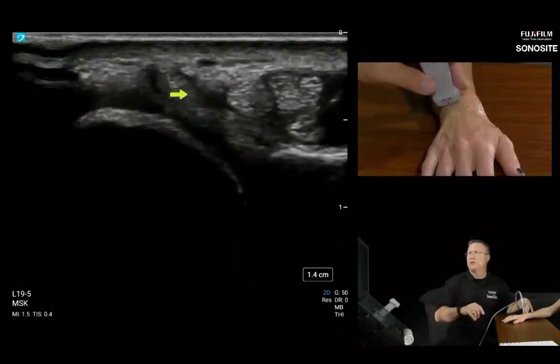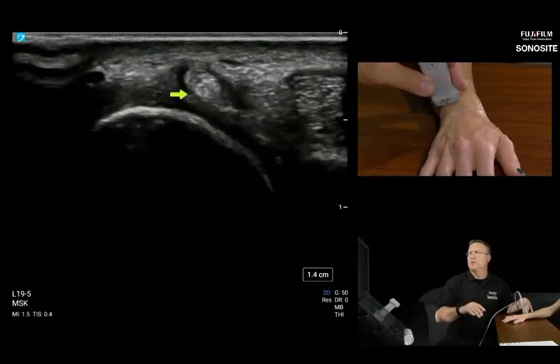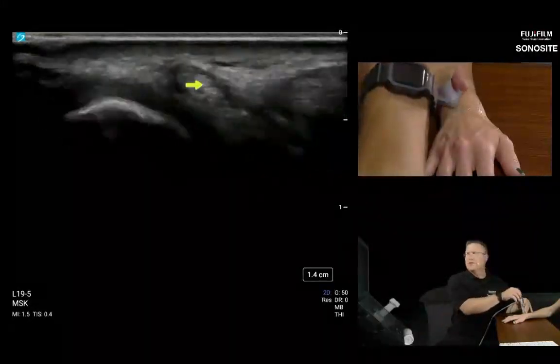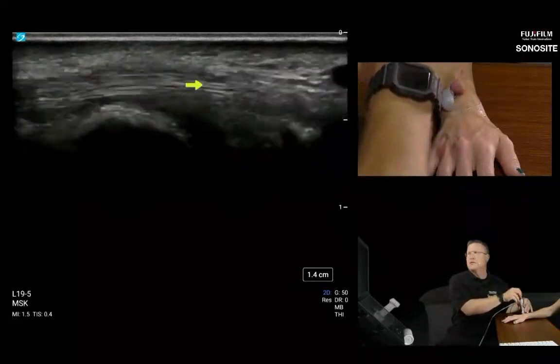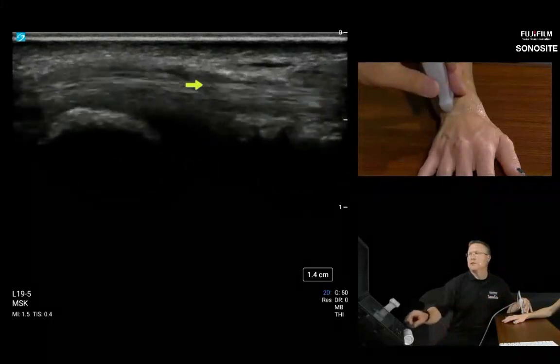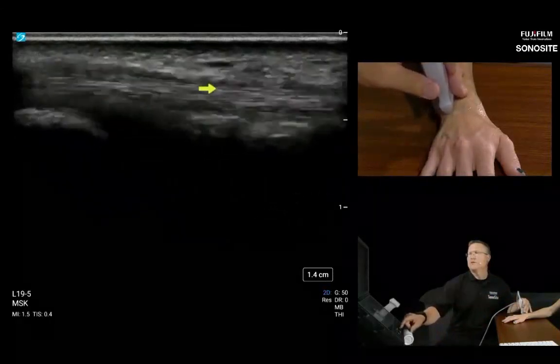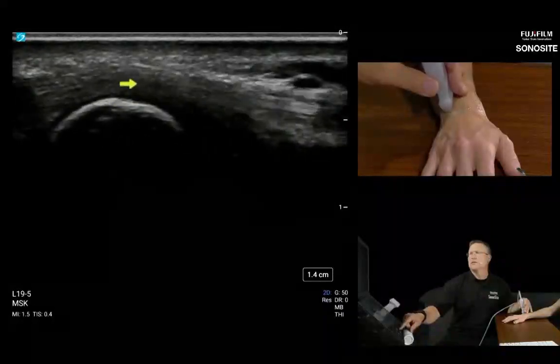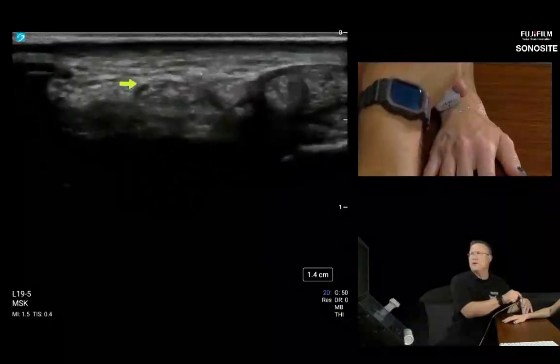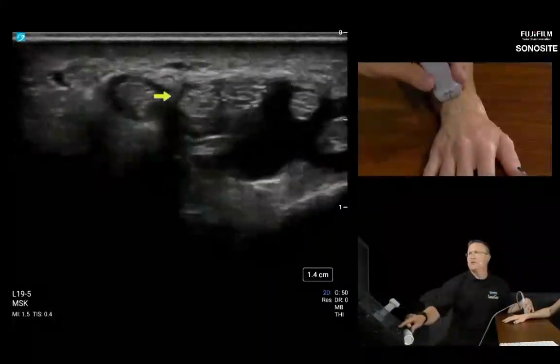Let's wiggle the pinky. And we can isolate that tendon in short axis, and I'm going to go long axis here and make sure that we are indeed isolating the compartment 5 tendon to the pinky, the 5th digit. Go ahead and relax. And I'm going to go back to short axis here. I scan with two hands all the time. Don't be afraid to scan with two hands. It really helps you maintain control of the transducer.